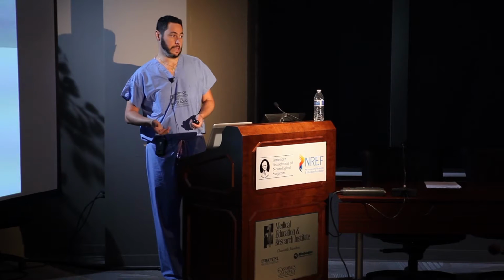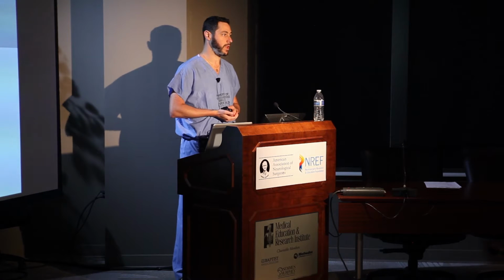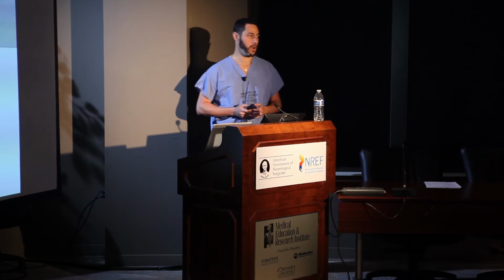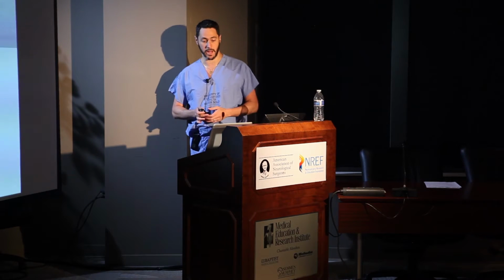That's why the surgeon really didn't want to operate and wanted to see if I could embolize it. And honestly, I didn't know if I could because I didn't have these pictures from the diagnostic angiogram. This is from the day of treatment.